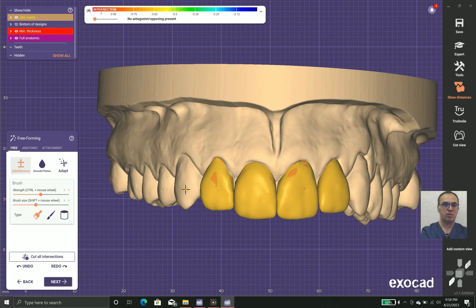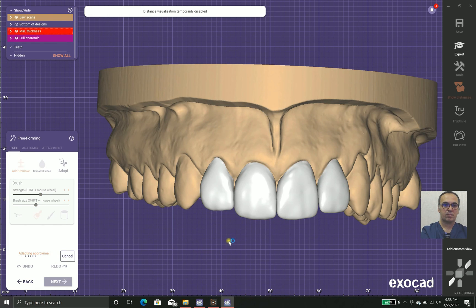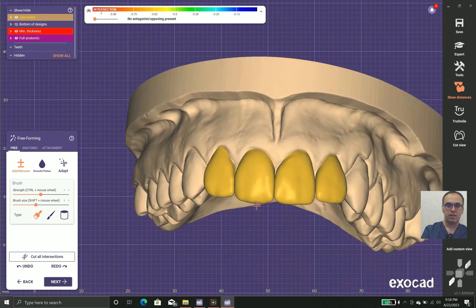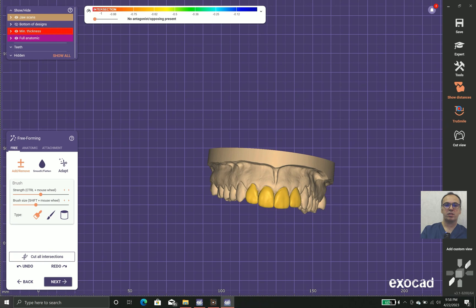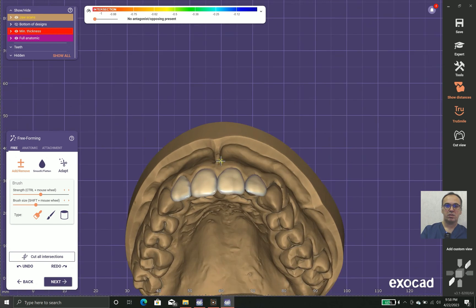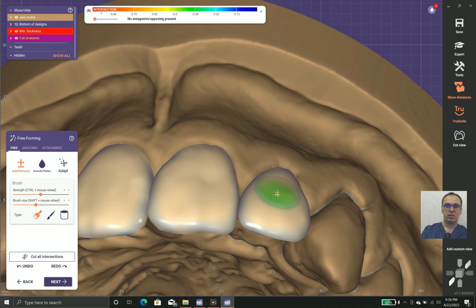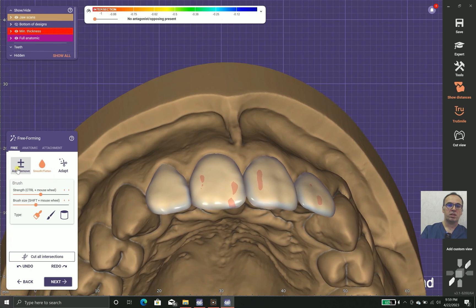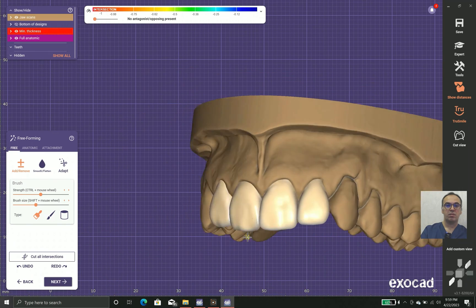Now I cut the intersections so the laminates don't collide with each other. The line angles still need refinement. I draw a smile line to check whether it looks right, and I add developmental grooves and other anatomy features to make the design more natural and beautiful. This serves two purposes: anatomy and minimal thickness — both are important.